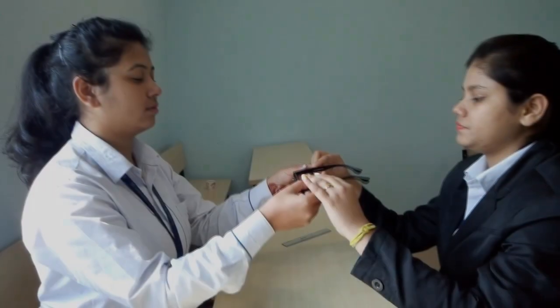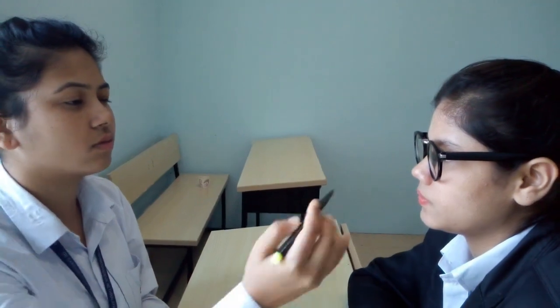Here, the examiner asks the patient to wear a spectacle. Then, the examiner closes her left eye and asks the patient to look at her right eye. The examiner marks the pupillary center on the frame with a marker.